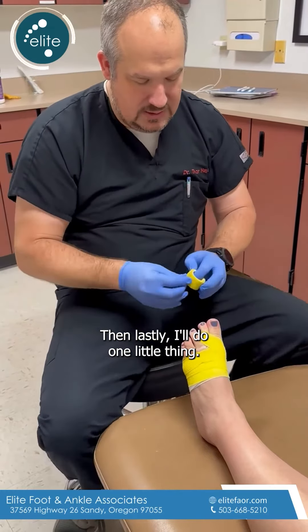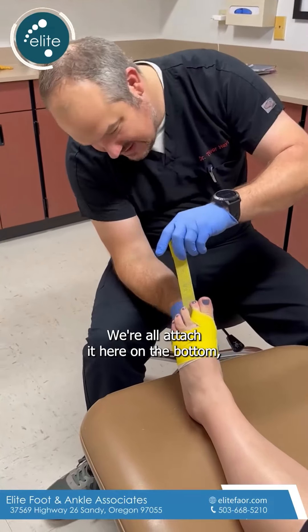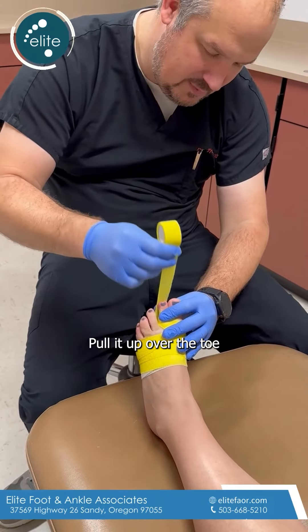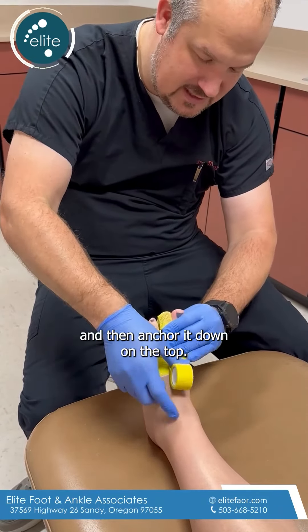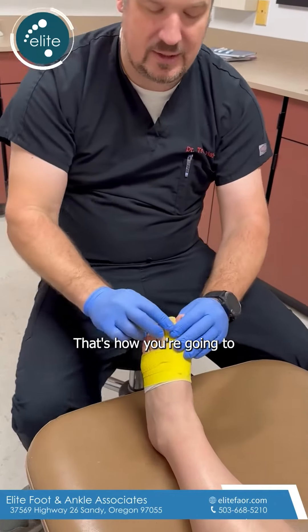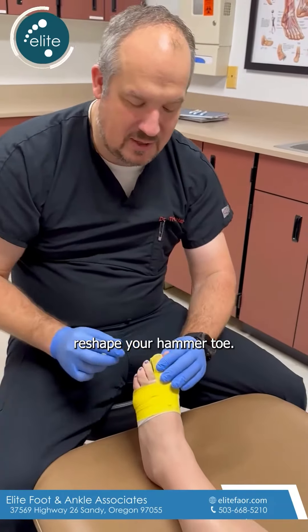And then lastly, I'll do one little thing where I'll attach it here on the bottom, run it down underneath the bottom of the toe, pull it up over the toe to help keep that toe straight, and then anchor it down on the top. And that's how you're going to retape your hammer toe.